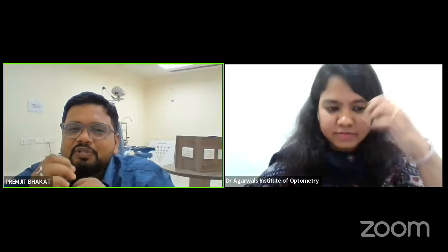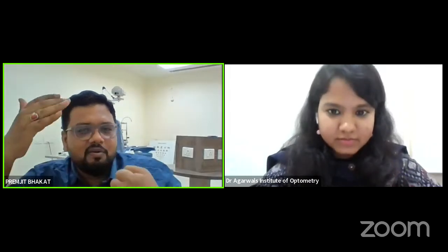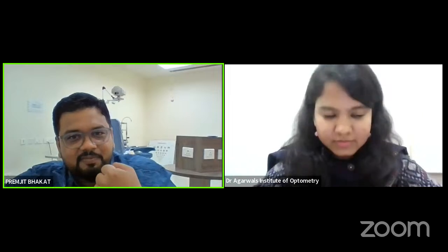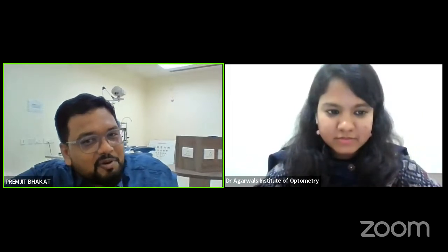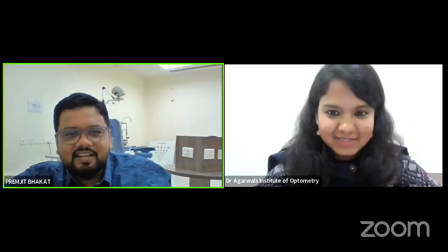So what happens in order to do the static fit? Static means when the eyes are not blinking. You see the lens-cornea relation by observing the tear. So tear is there between lens and cornea. Now the lens is transparent, your cornea is transparent, so you do not know what is happening between the lens and cornea. What is present? Tear. Now you become very intelligent: you just touch a little fluorescein there. Now the tear has a color. Now you understand if tear is present or absent there. It helps you to understand the fitting, especially static fit for RGP contact lenses.